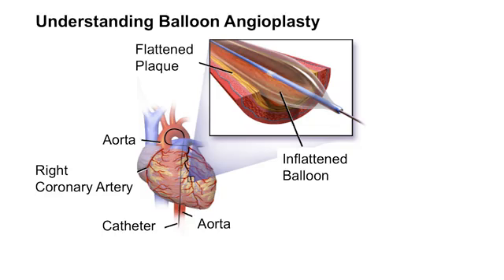What is balloon angioplasty? It follows the same procedure. You do the same local anesthesia, the same puncture, you put in the sheath, you put the wire up to the aorta and the sinuses down here, and then you use a larger catheter which is also hollow, and you can put any type of material you require through this catheter. So now we have the catheter inside the coronary arteries. We do a small injection, and we see that this artery is occluded.